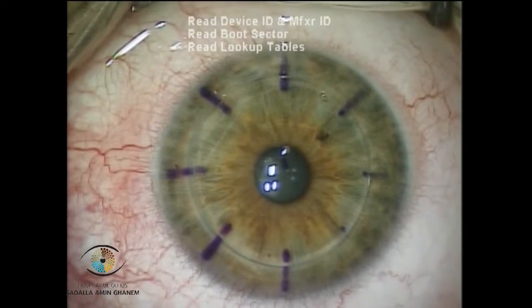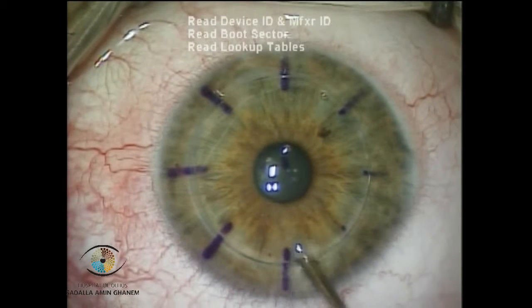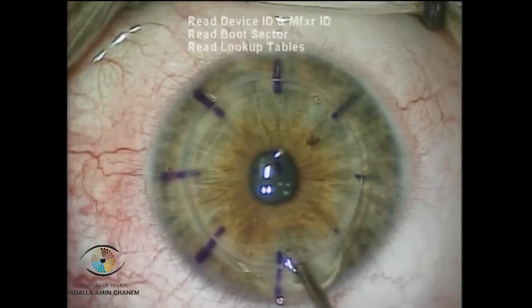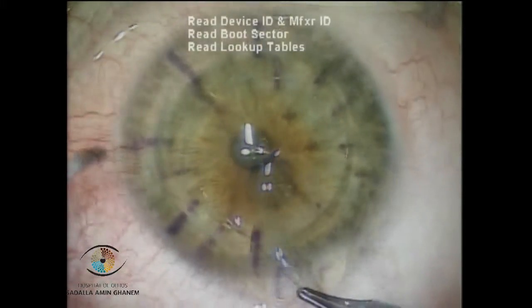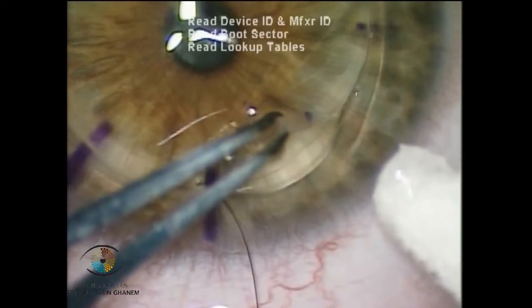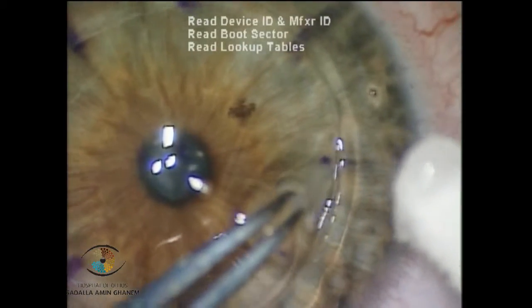First, you have to find where the perforation is, then fill the anterior chamber with viscoelastic — here with methylcellulose — and then do your best to remove as much stroma as you can. Sometimes a complete stroma removal may be achieved.